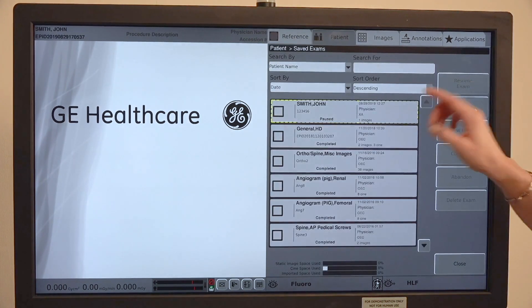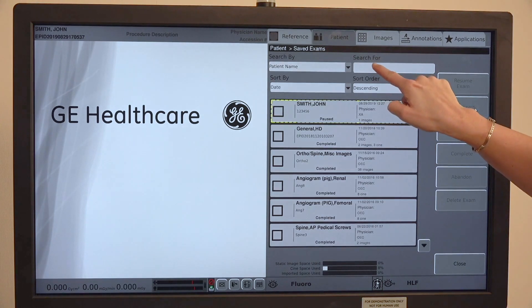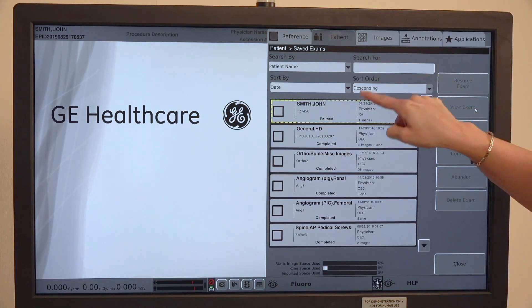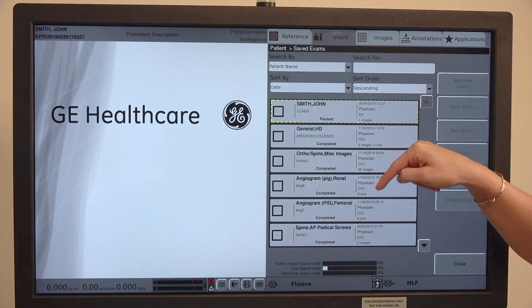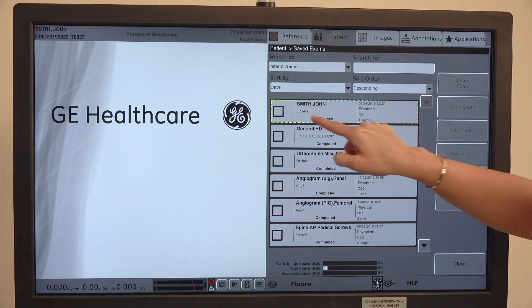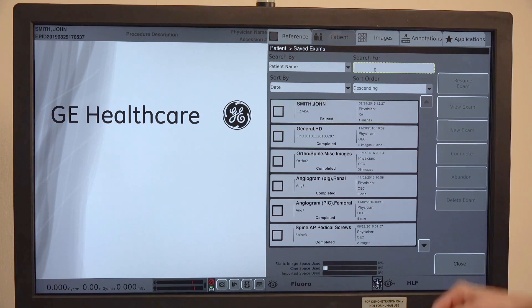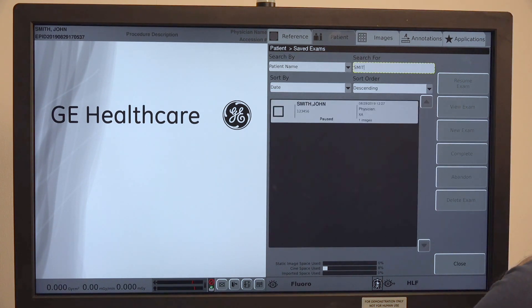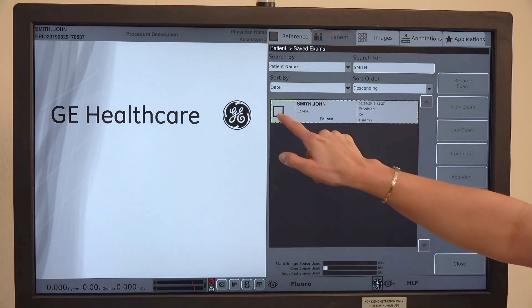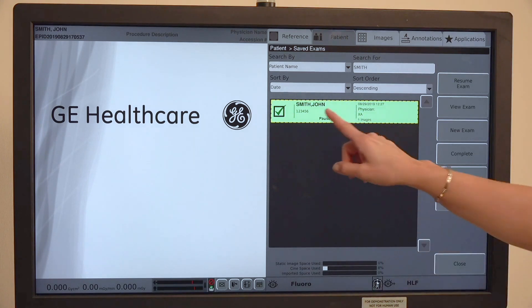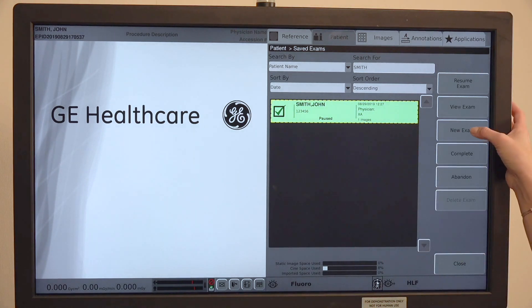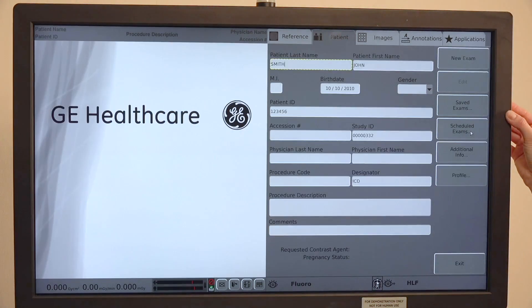You can search by name here or you can scroll down, but you'll want to find the patient that you are entering in. I'm looking for John Smith, and then you select it by putting a green check mark in the box and then you're going to hit new exam here.